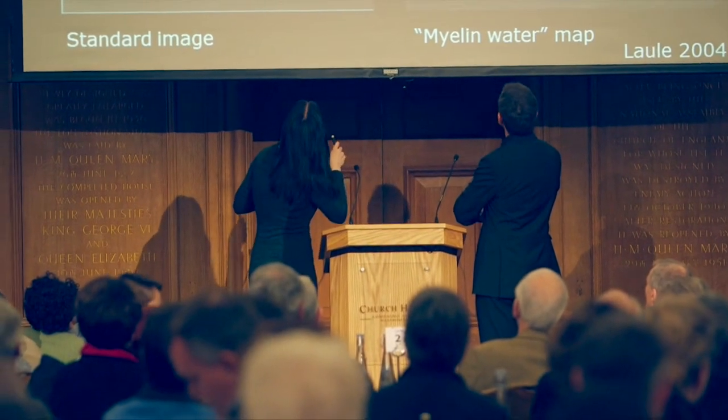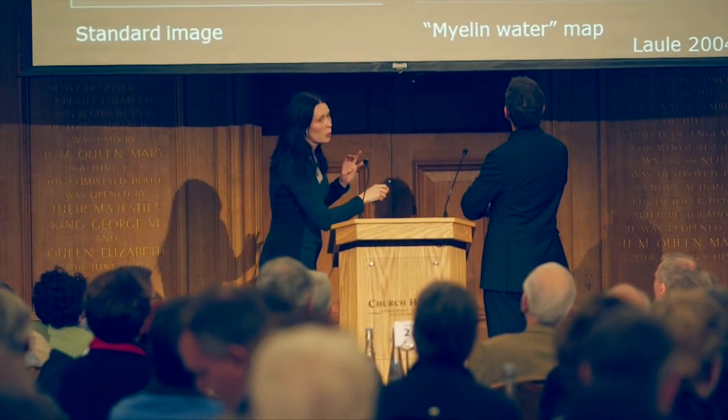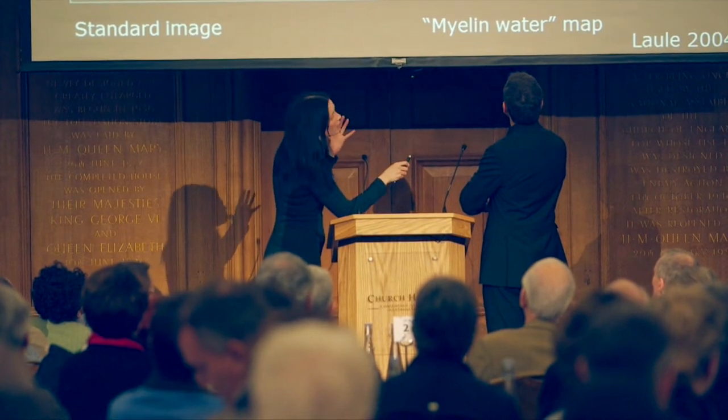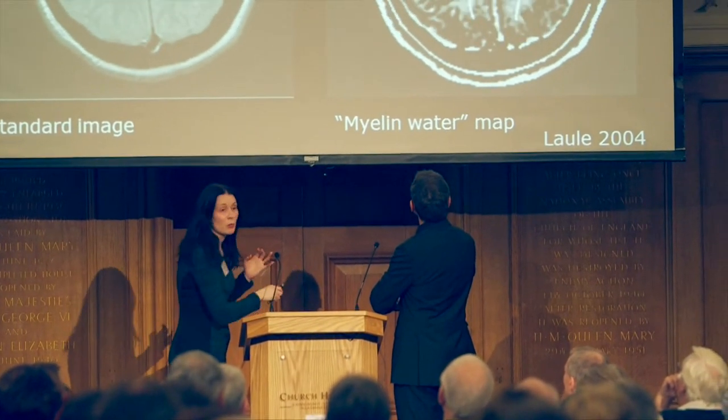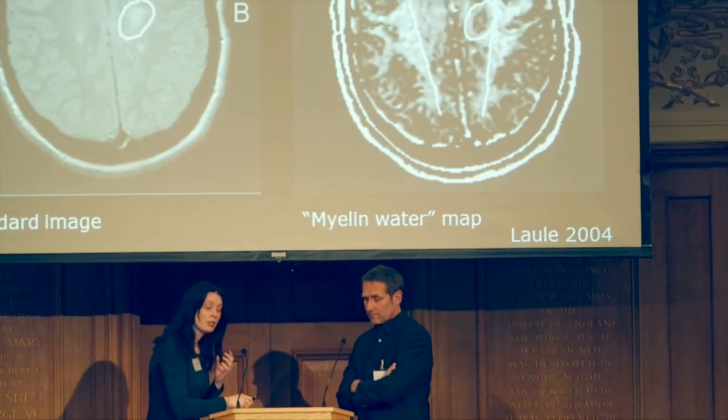And here, this lesion, quite interesting, I can see that there may be some signal regained there, so that may mean that we're able to monitor remyelination in these lesions.